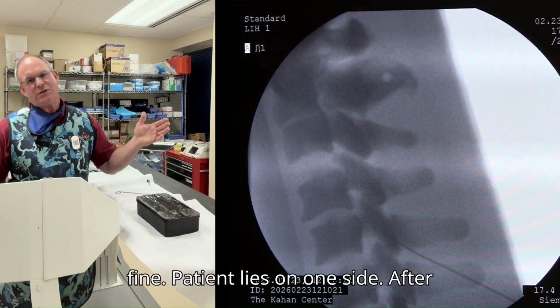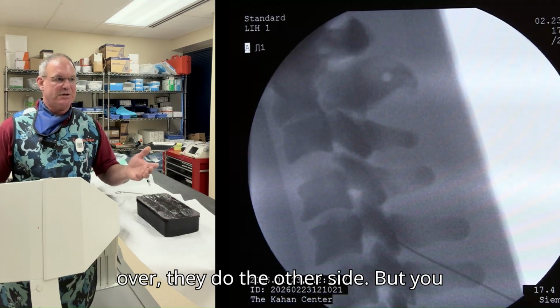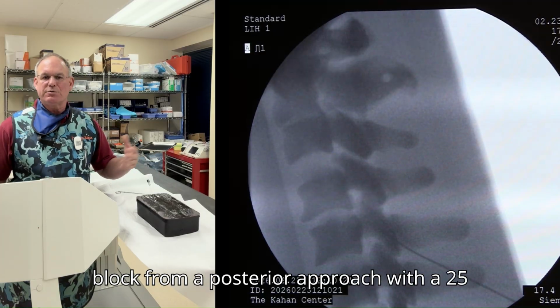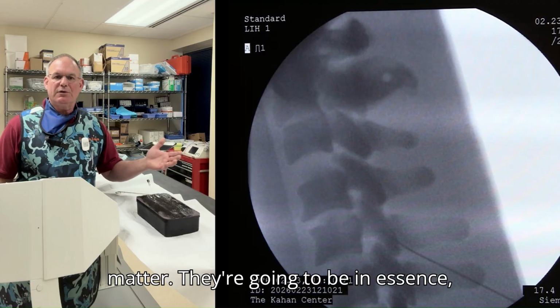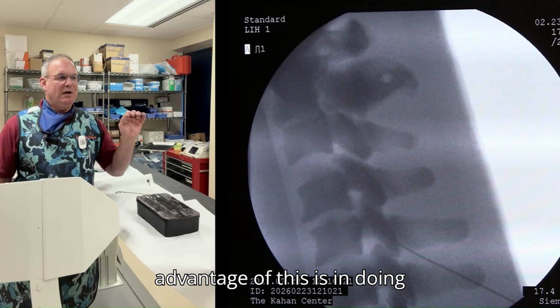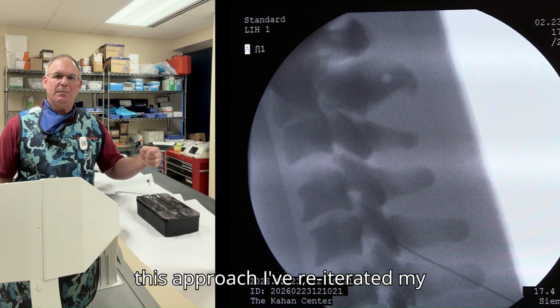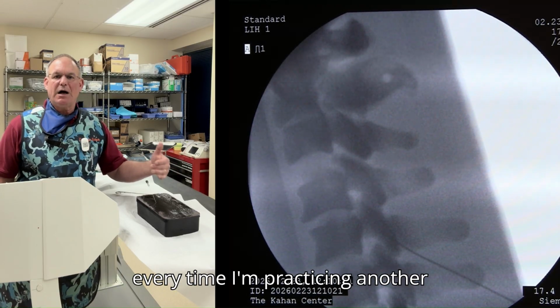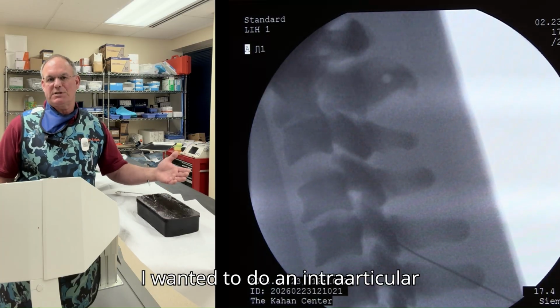That's fine. Patient lies on one side. After you're done with one side, you turn them over, they do the other side. But you know, when you're doing a medial branch block from a posterior approach with a 25 gauge needle, 3.5-inch, doesn't matter. They're going to be anesthetized, they're not going to feel it. The advantage of this is, in doing this approach, I've reiterated my experience of doing radio frequencies. So every time I'm practicing another technique by doing the same approach.